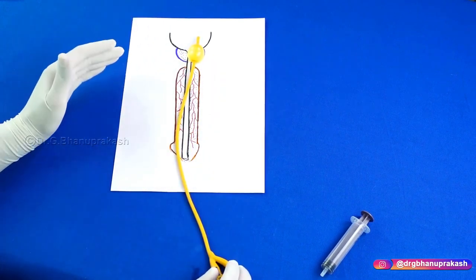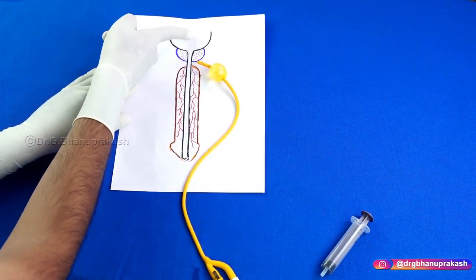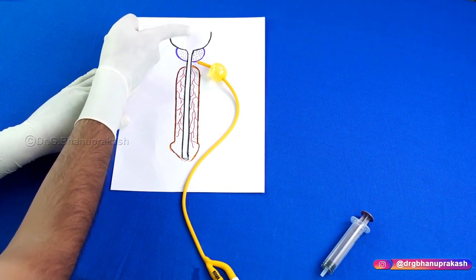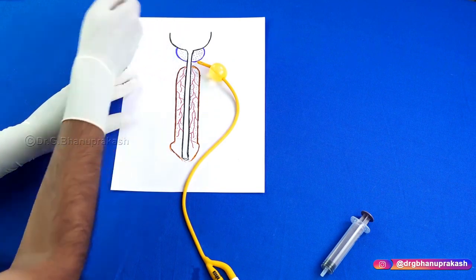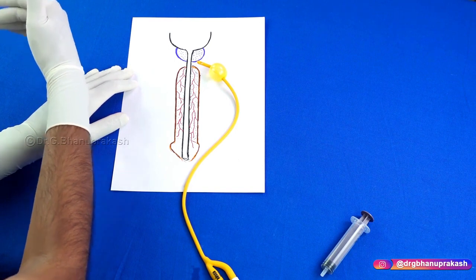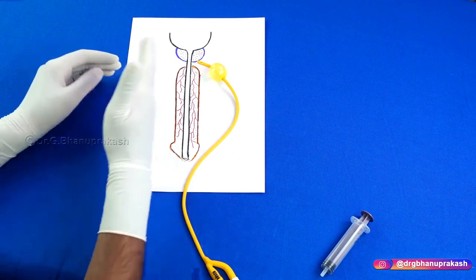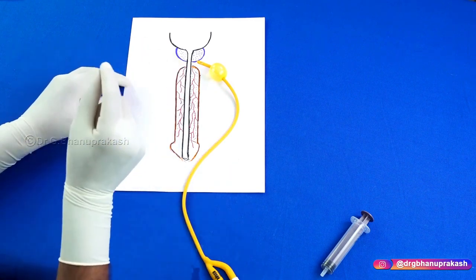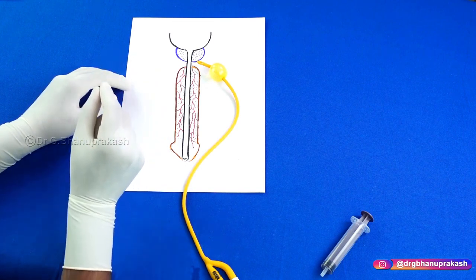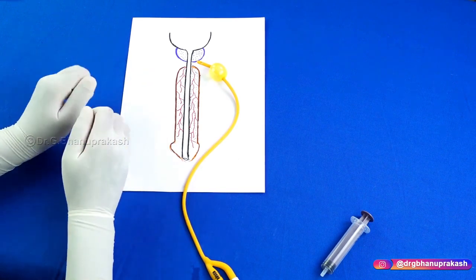No. So in that case, you have to make a small opening in the bladder region. Where is the bladder located? The bladder is located above your pubis. So in the suprapubic region, you need to make a small incision and put a port over there and put a catheter over there. This is called suprapubic catheterization. Okay. So in any kind of penile injuries, any kind of injuries to the penis, you never ever put a Foley's catheter, and that is a contraindication. You always use a suprapubic catheter. So this is the way how you use a Foley's catheter.